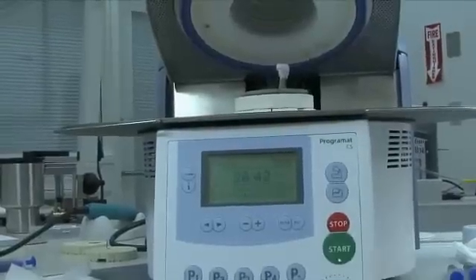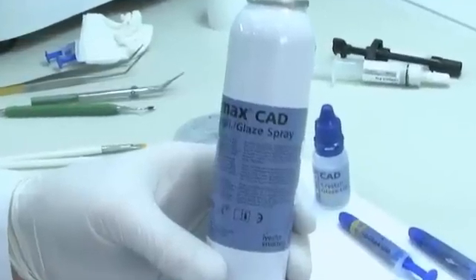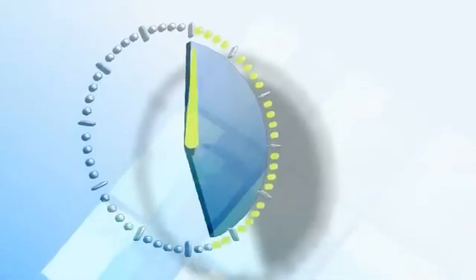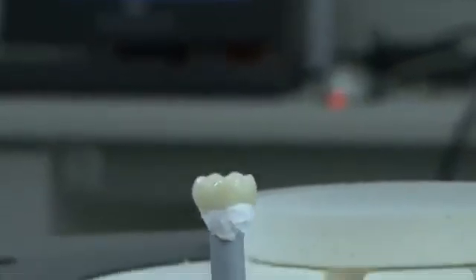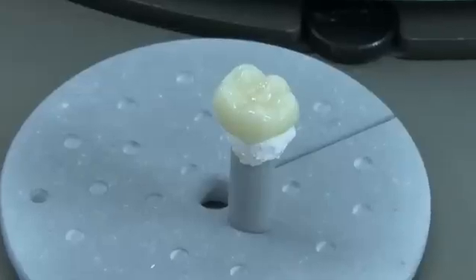and press Start. When utilizing IPS e.max CAD glaze spray and firing up to 2 restorations, speed crystallization parameters may be used to allow for a crystallization time of under 20 minutes. When the firing process is complete, the Programat CS will open, and you will be able to remove your restoration. Allow for further cooling of the restoration prior to cleaning and cementation.